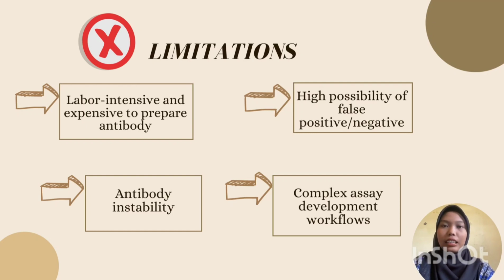Next is the limit of antibody instability, because refrigerated transport and storage are required as an antibody is a protein. Lastly is a complex assay development workflow. This includes several time-intensive wash steps during this technique.